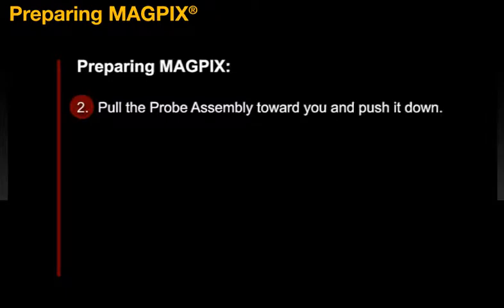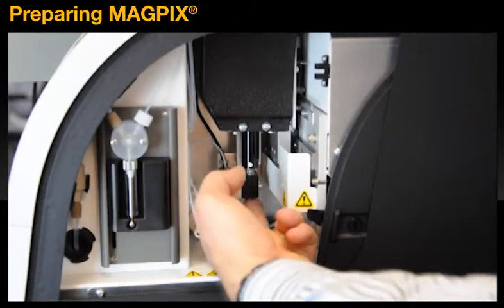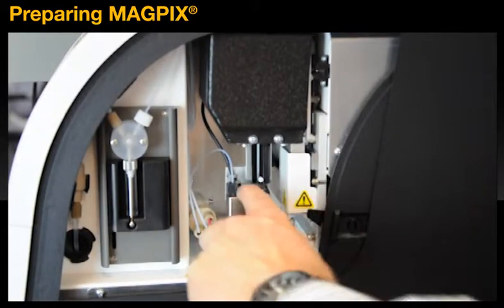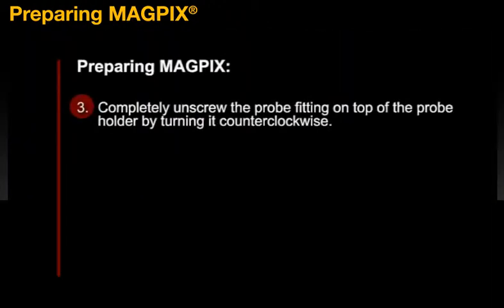Next, pull the probe assembly towards you and push it down. Your third step is to completely unscrew the probe fitting on top of the probe holder by turning it counter-clockwise.